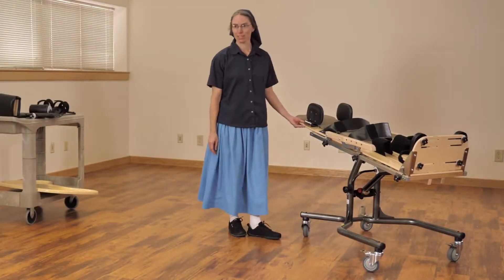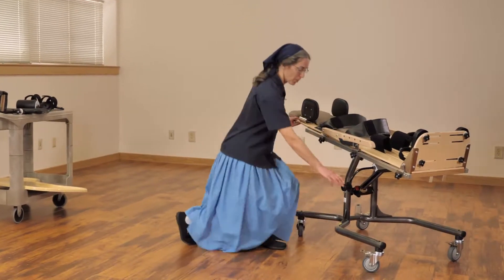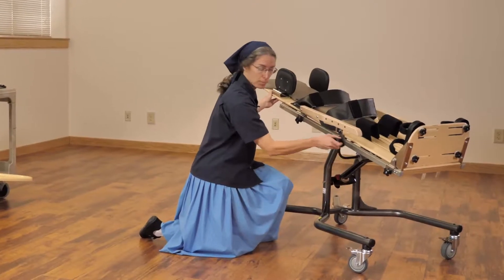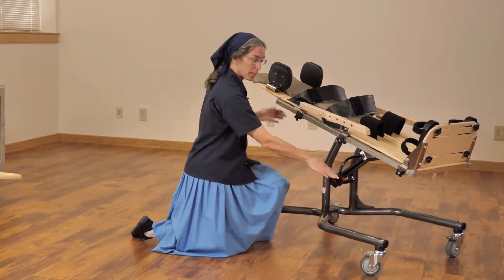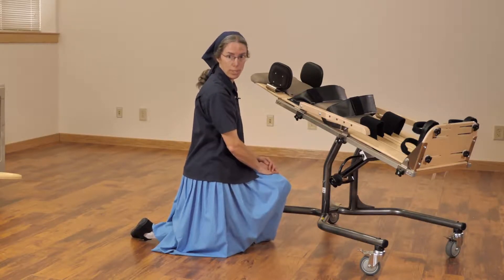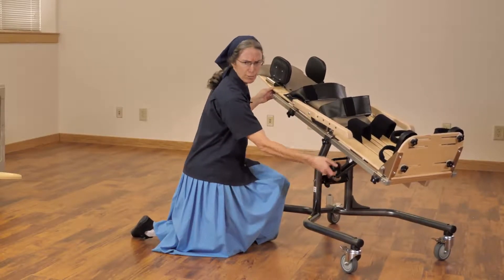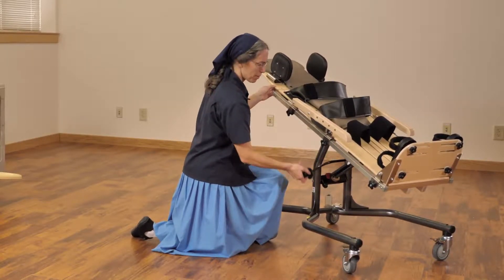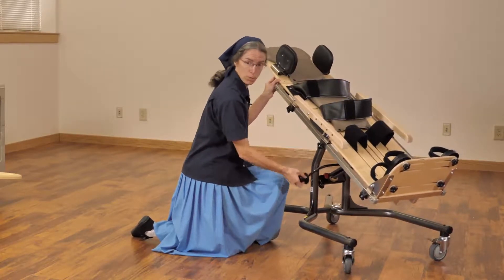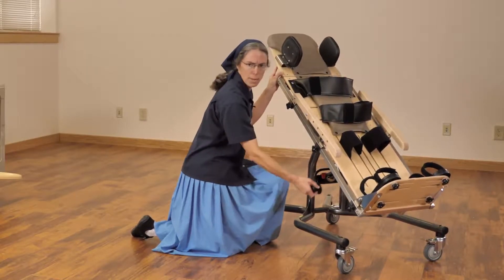This is Rifton's supine stander — this one is the small. We also offer a large supine stander. You'll notice that the movement from horizontal to vertical is gradual. With our large supine stander, you actually have some height elevation in the horizontal position to enable better ease of transfer. You can imagine this stander being appropriate for a medically fragile child, perhaps with a spinal cord injury on a ventilator, where you need to move slowly from supine to vertical without the risk of orthostatic hypotension.